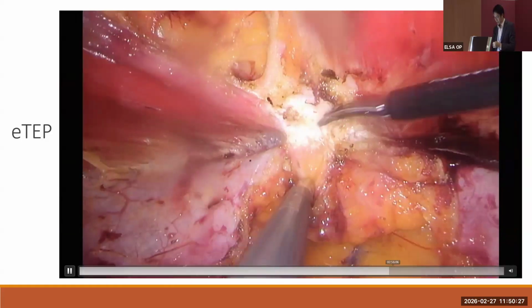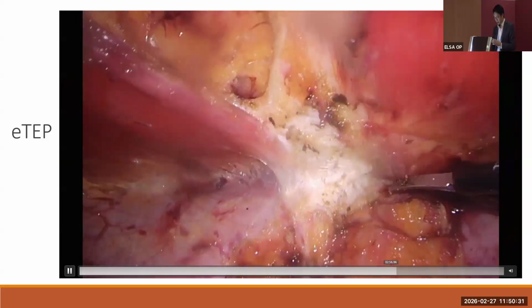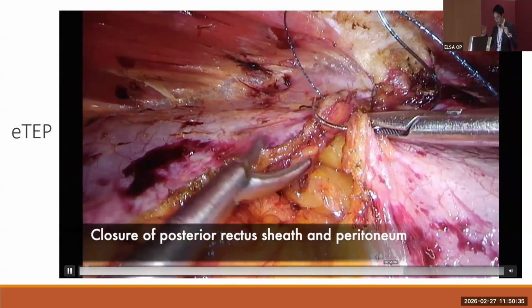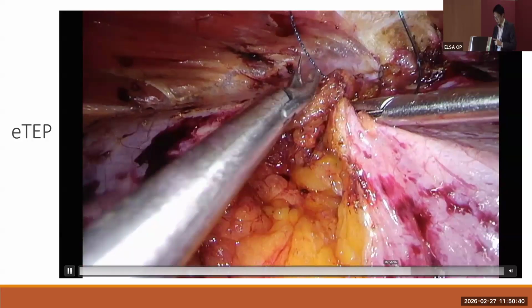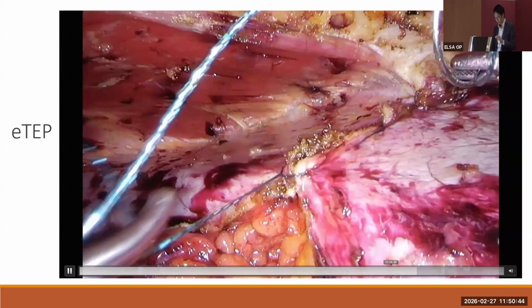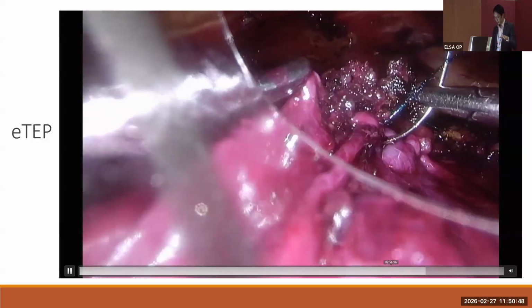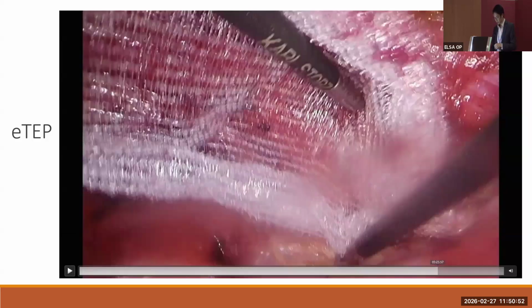Of course, the other technique is just to use the intracorporeal suture. Okay, so we dissect. Along the linea alba there tends to be a bit more adhesion. So just ensure you get enough space superiorly and inferiorly. Right, this part, because we went through the posterior sheath to reduce the hernia, you can see that we're closing it right here.